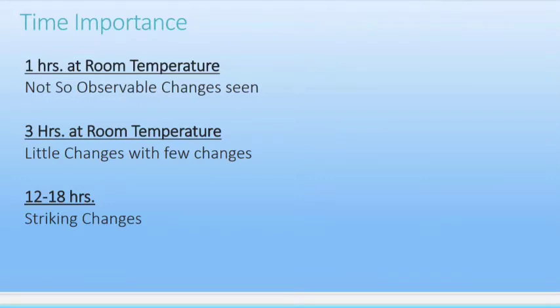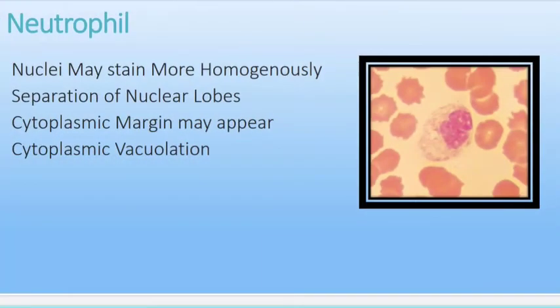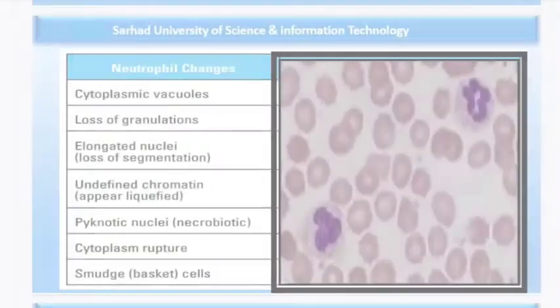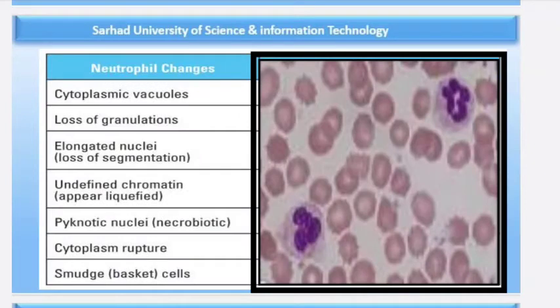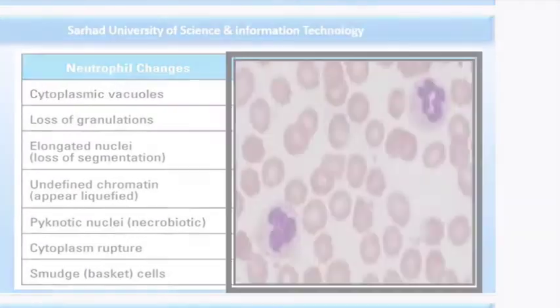Some, but not all, neutrophils are affected. The changes observed in neutrophils include nuclei that stain more homogeneously than in fresh blood, nuclear lobes that may become separated, and cytoplasm margins that may appear ragged or less well defined. Small vacuoles appear in the cytoplasm.